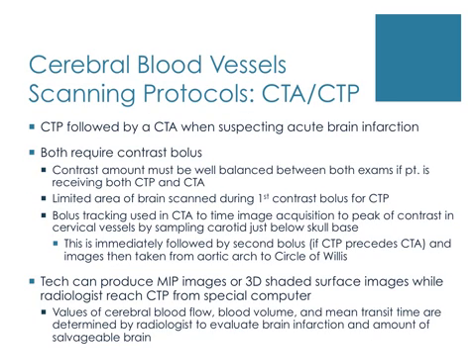CTP, which is CT brain perfusion, is a perfusion study that we mentioned earlier in the presentation, and is best used when a suspected acute brain infarction has occurred. It usually is followed immediately by a CTA. The CTP and the CTA both require injection of a bolus of contrast.